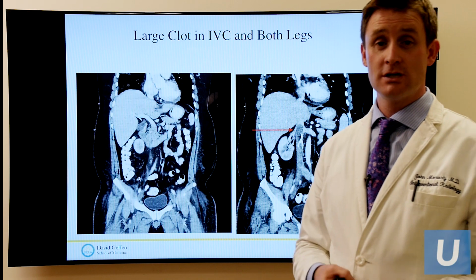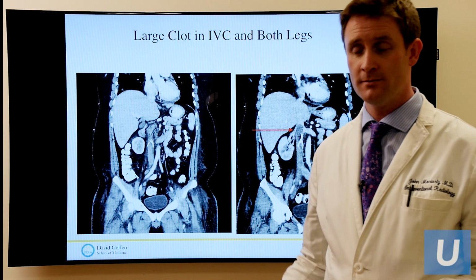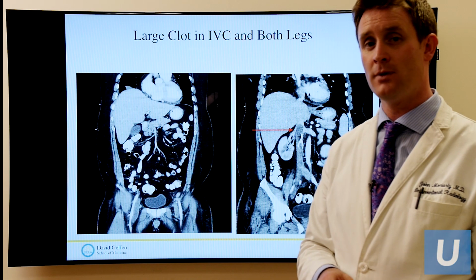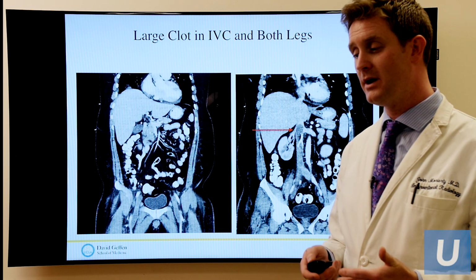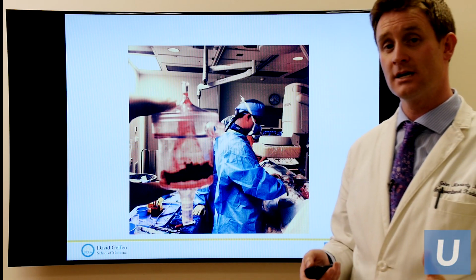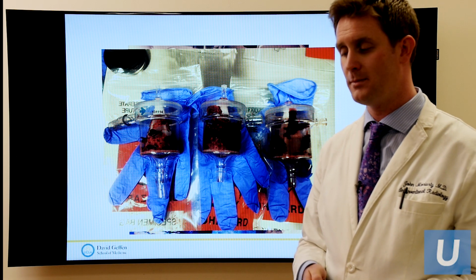This is the sort of patient who may benefit from it. Someone who has a large volume clot, a big clot that goes all the way from the knees, all the way through the hip, all the way through the belly, all the way up into the main part of the abdomen. And this is a big clot. This is causing huge leg swelling, and we're able to go in. You can see here this picture of some of the clot that we were able to suck out, remove, big volumes of clot that otherwise would have been very difficult to treat just with drug therapy alone.